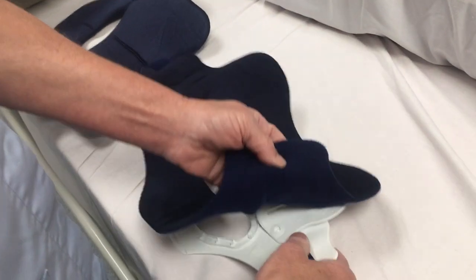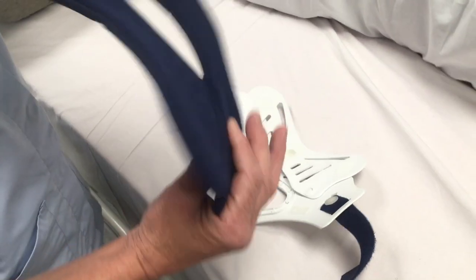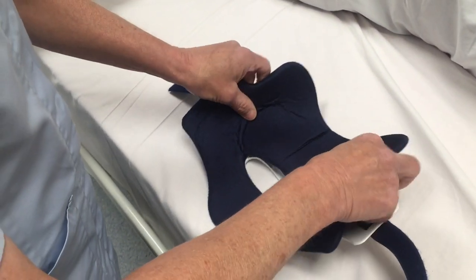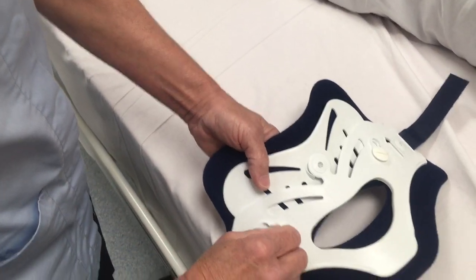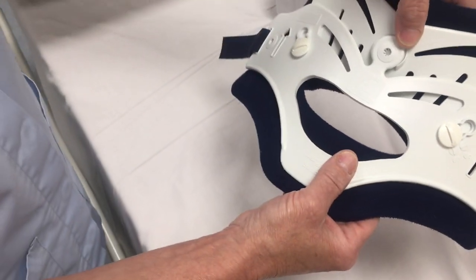At this point we can change the liner for a fresh one, making sure that the soft side fits against the collar. Turning it over and checking you've got a good margin of blue on all edges and that your directional arrows are locked.